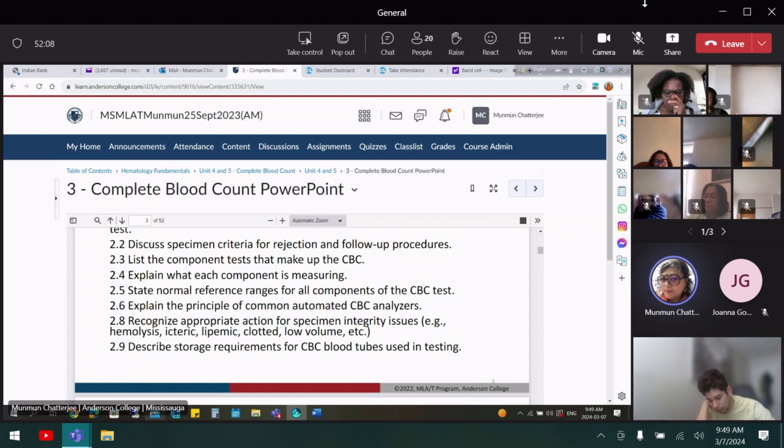And on another page, how many of you have seen that one? It looks like Evelyn and one or two are giving the answer. All look very quiet, silent. It looks like I didn't give you anything. So in the other sheet, I give each tube, the color of the tube, and what type of test can be done. Please go through that one. That is very important.